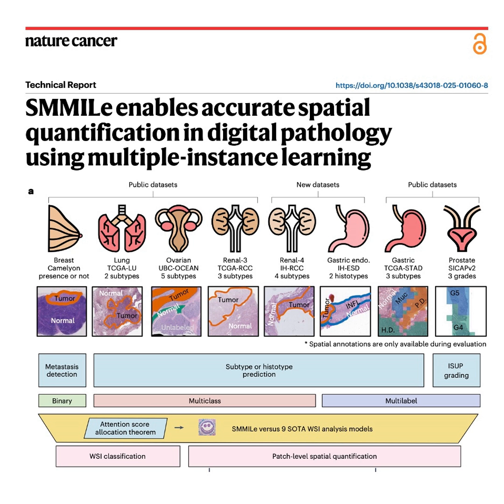I always like to think of multiple instance learning like a massive college group project. That's a great way to put it. Yeah, imagine the entire gigapixel slide is the bag. That's the final group project submitted to the professor. But because the image is too big, we chop it up into thousands of smaller, digestible patches. The instances. Right, those patches are the instances, the individual students in the group.